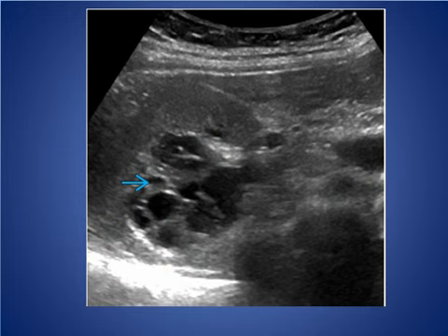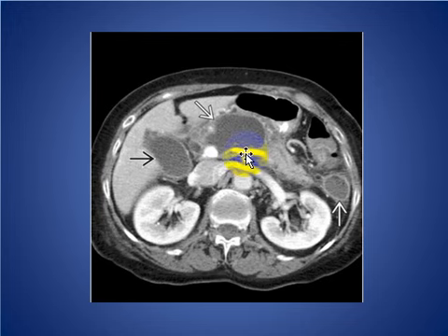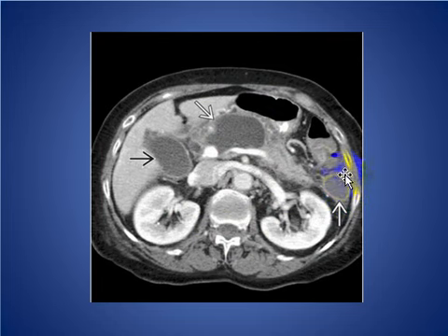Pancreatic pseudocyst: the most common pancreatic mass, especially in symptomatic patients with history of alcohol abuse or gallstones. Here we see a contrast axial CT scan with a pseudocyst in the neck and body of the pancreas, and another cyst in the left pararenal area with an enhancing wall, indicating infection. The gallbladder is also visible.